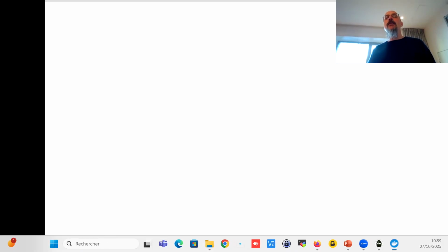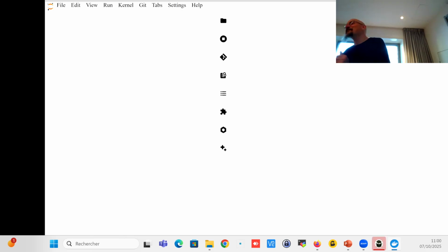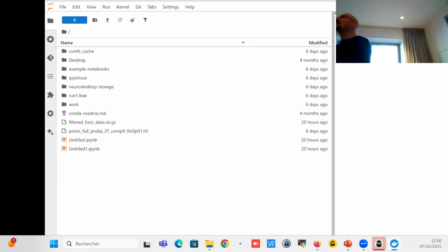So you need something else. You need a little bit of space on your computer. The container is 2 GB, but for this afternoon we will download some data sets into it. So it will be around 10 GB of data and processing. I'm seeing some people that maybe don't have 10 GB on their computer.